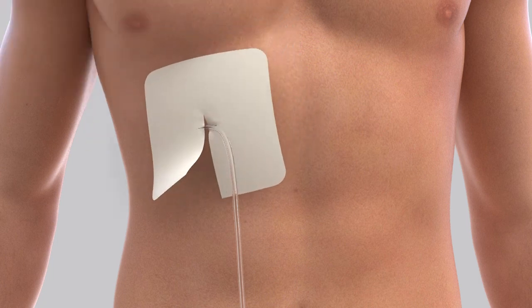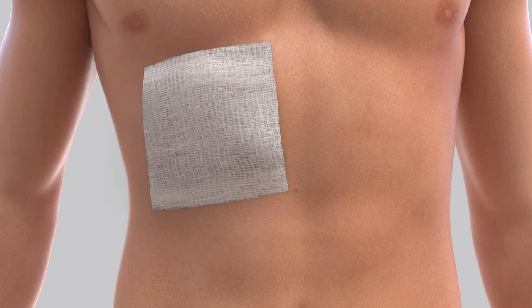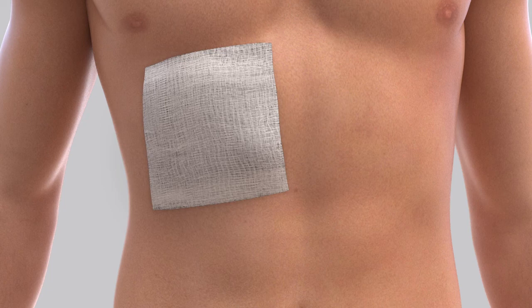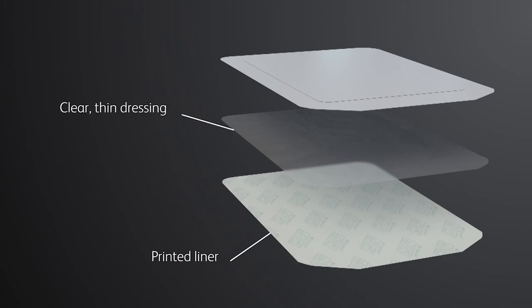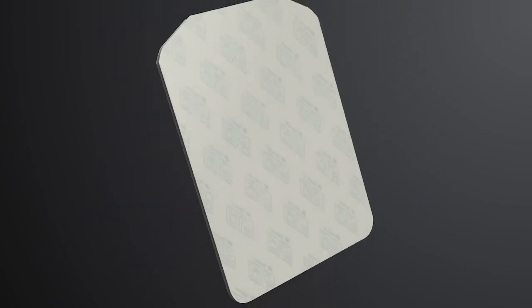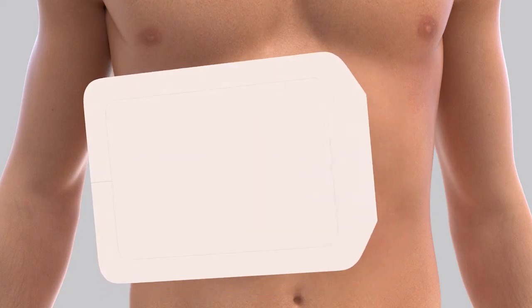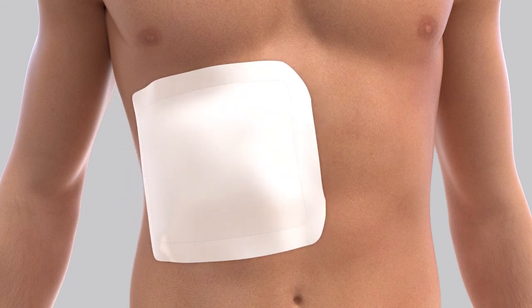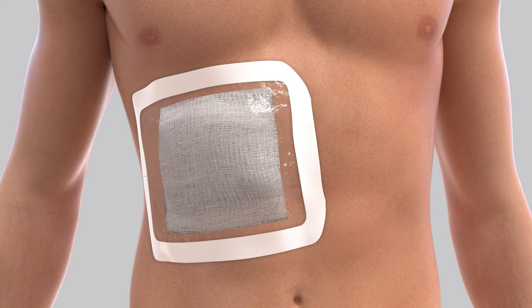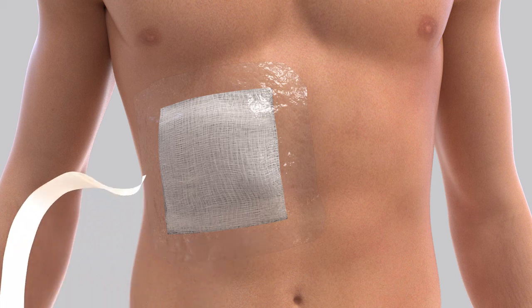Clean the skin around the catheter site using the last alcohol pad. Place the foam pad around the catheter. Wind the catheter in loops and hold it on top of the foam pad, then place the gauze pads over the catheter. The self-adhesive dressing has three layers: a printed liner, a clear thin dressing, a center panel, and frame paper backing. Hold the self-adhesive dressing and peel the printed liner from the dressing to expose the adhesive surface. Center the dressing over the gauze pads and press it down — do not stretch the dressing during application. Remove and discard the center panel from the backing. Slowly remove the frame while smoothing down the edges using firm pressure to ensure adhesion.